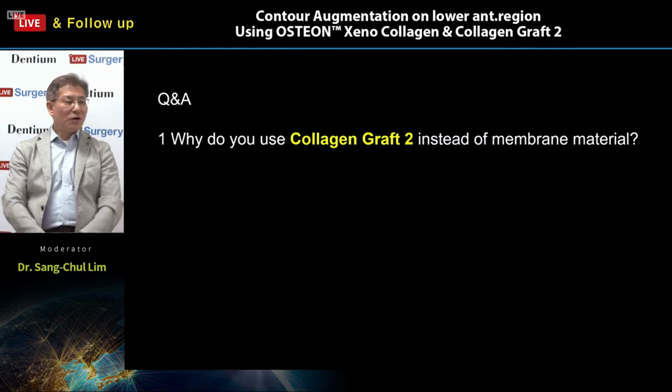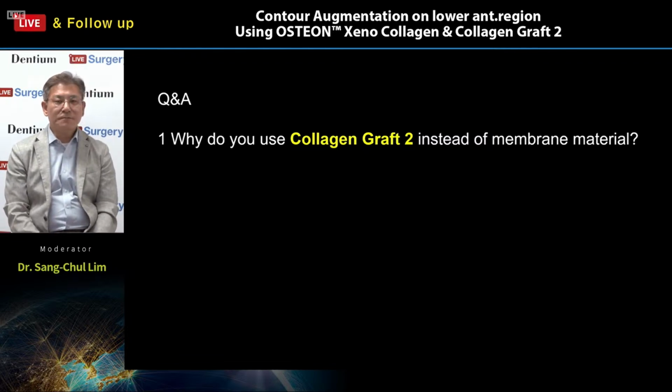Okay, thank you for this question. One question was here: why do you use collagen graft instead of membrane material?